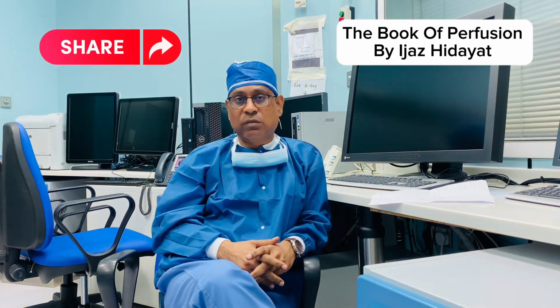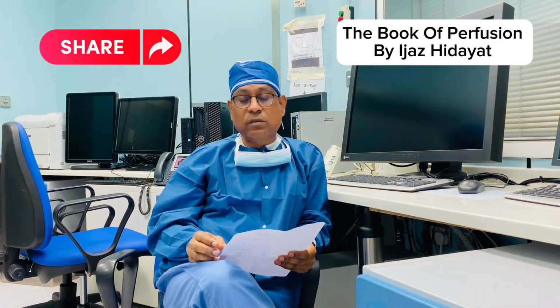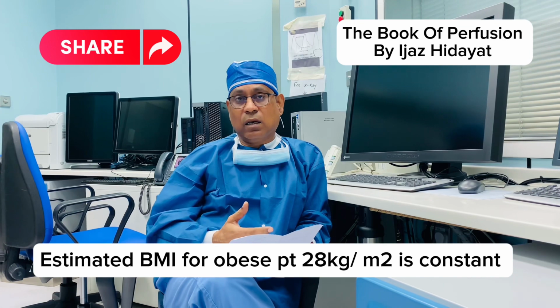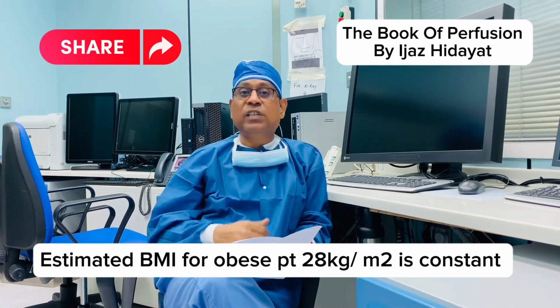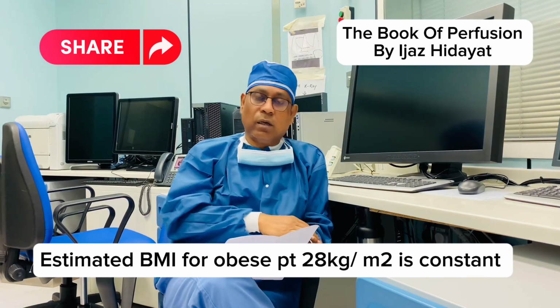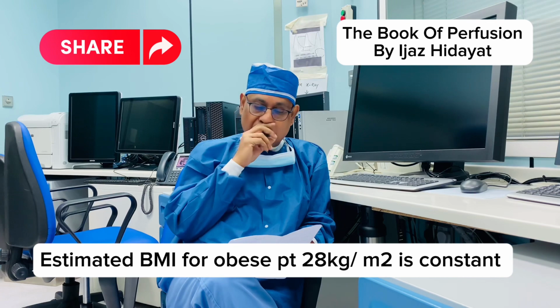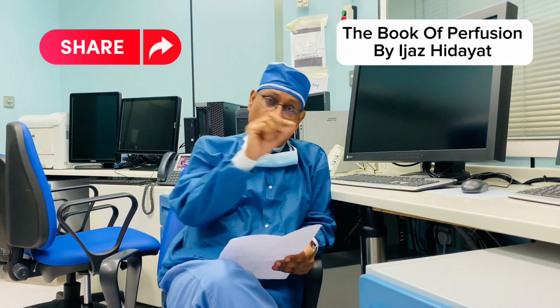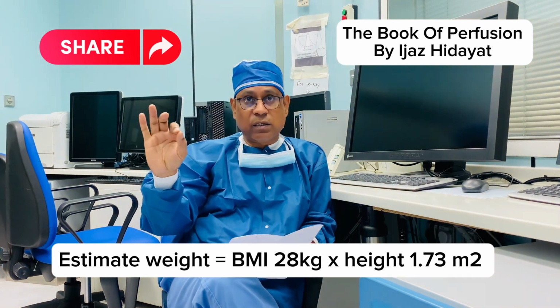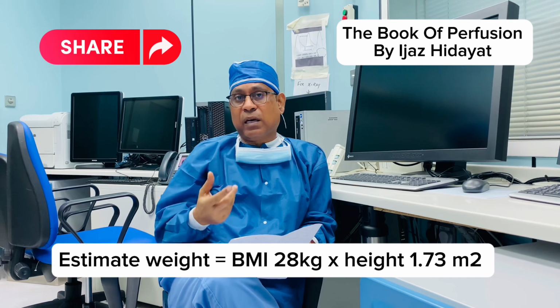Once you convert the centimeters into meters, for the formula we normally take an estimated BMI of 28 for overweight or obese patients. So 28 kilograms per meter square. We multiply 28, which is now a constant, because we took 28 as the estimated BMI.